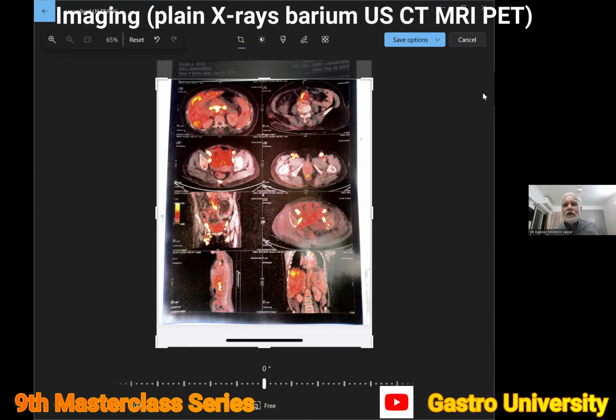Thank you. To highlight what Dr. Sanjay Gambhir said, a very important point, I am just showing a picture. I hope you can see it. This is somebody known to me, a young lady who had multiple lymph nodes all over the body. The clinical diagnosis obviously was lymphoma because she had some systemic symptoms also. A PET was done, which showed involvement of each and every group of lymph nodes, including a lesion in the liver. And then, fortunately, the biopsy showed that this is tuberculosis. So she is now being treated with ATT.